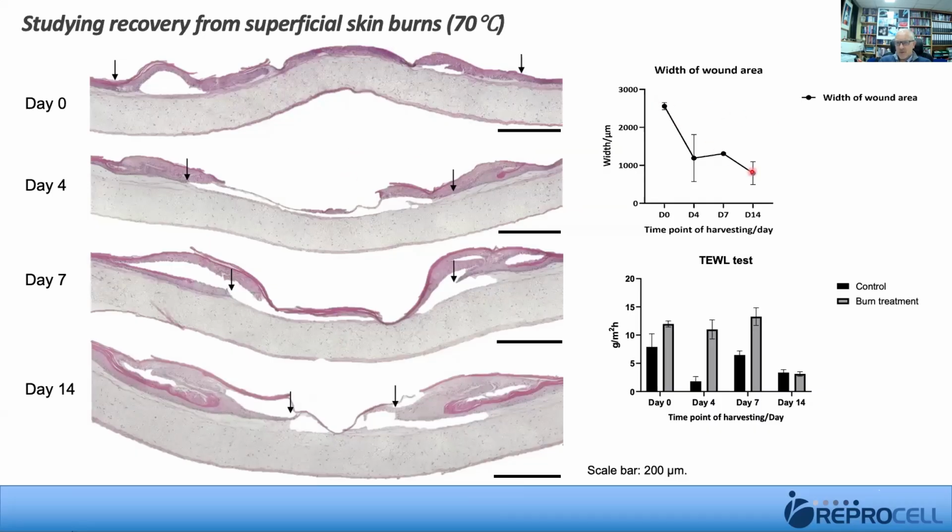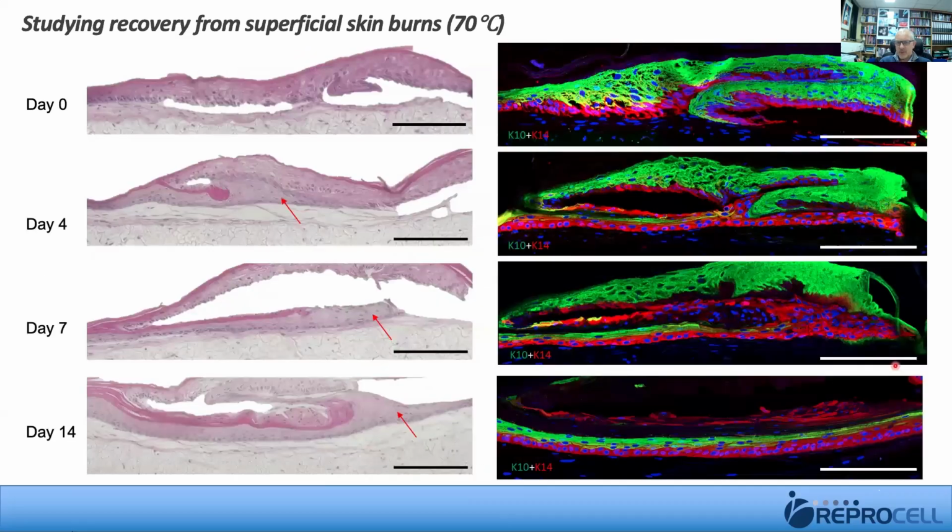You can take measurements from this, and you can also see how the water loss from that area is also changing. We've also got machines for imaging directly from the surface, so you can do this in a live model in the presence and absence of different formulations to enhance wound repair. And you can look in detail, if you wish, at the various molecules expressed and regulated during the recovery.